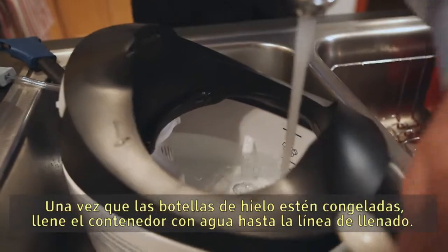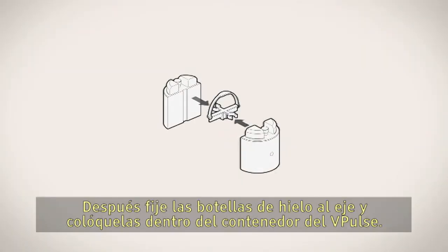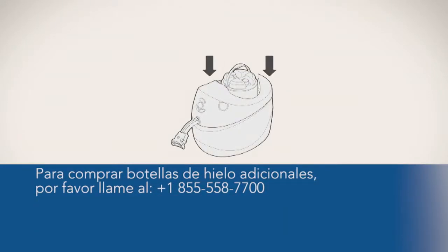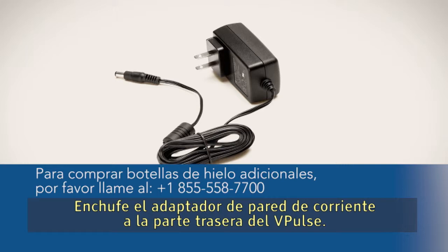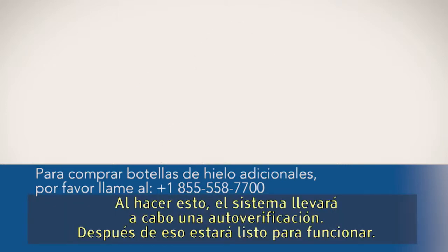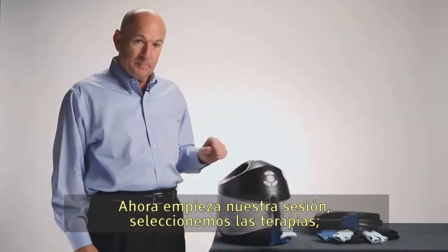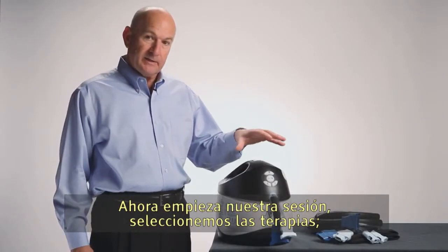Once the ice bottles are frozen, fill the container with water to the water fill line, then attach the ice bottles to the tree and place inside the container of the V-Pulse. Plug the power wall adapter into the back of the V-Pulse — in doing so, the system will perform a self-test. Afterwards, it is ready to go.